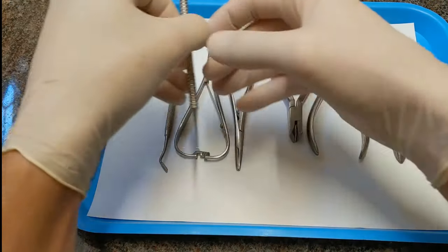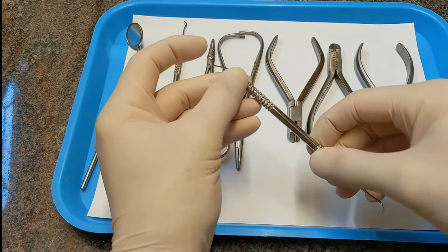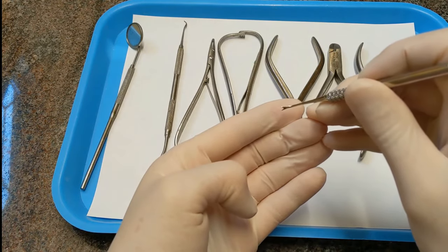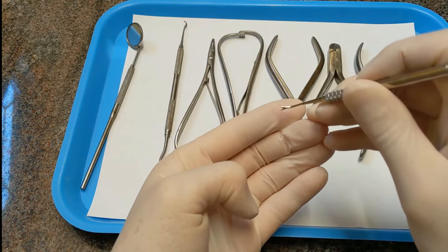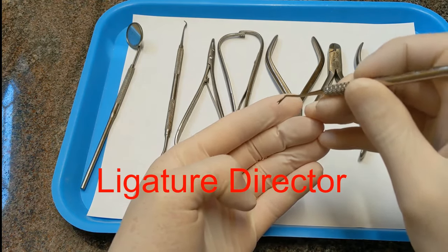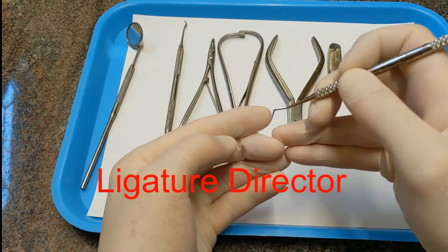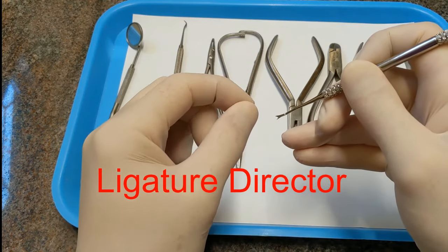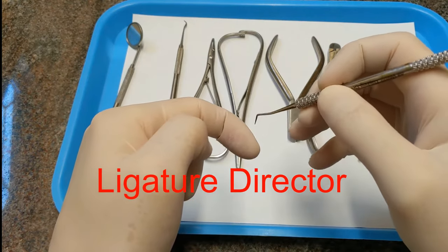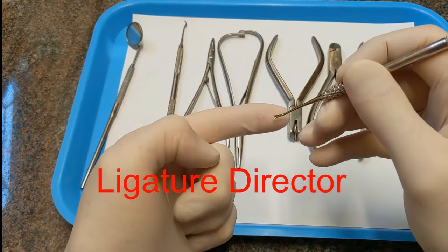The other end of these — here's your explorer end — this end has sort of a little forked tongue, like a little snake's tongue. This is called a ligature director. You use this to push an arch wire into place, or when you've cut a ligature wire and want to tuck it under the arch wire, you can use it to do that.